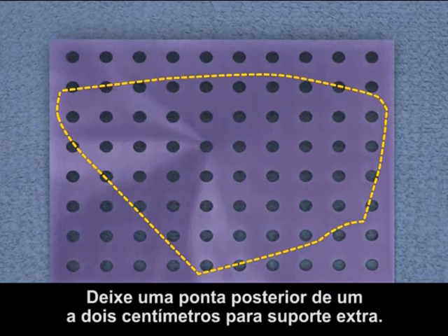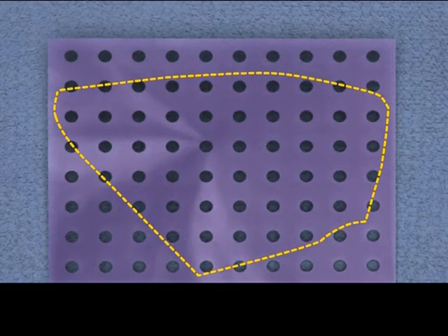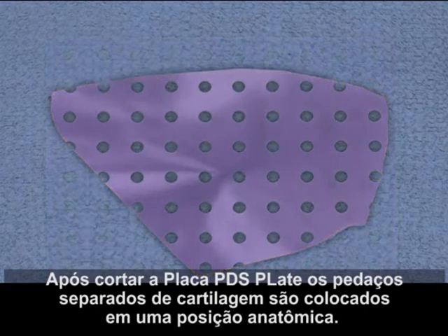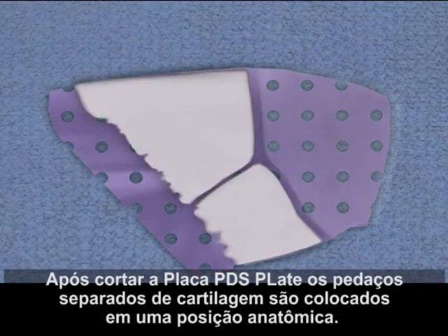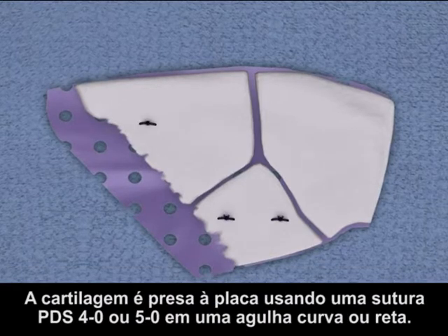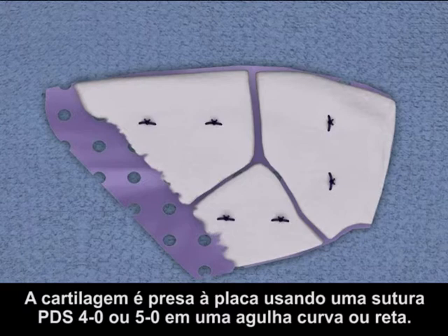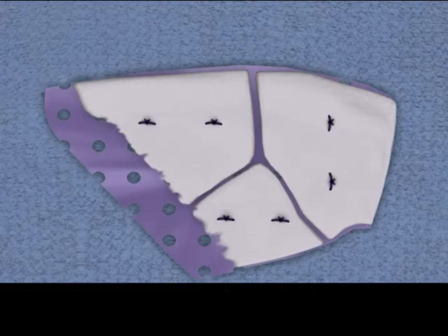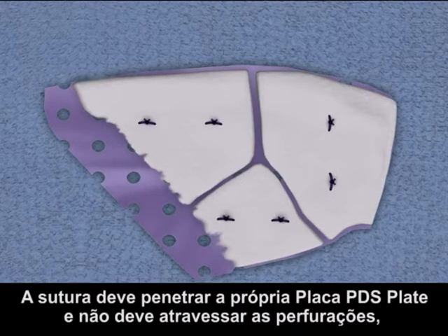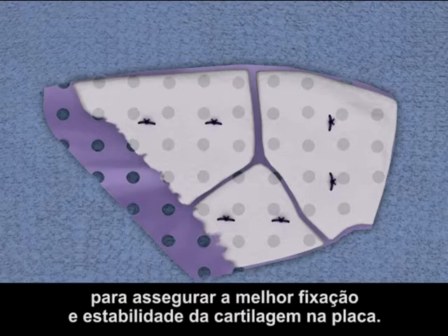Leave a one to two centimeter posterior tail for extra support. After the PDS Flexible Plate is trimmed, the separate pieces of cartilage are placed in an anatomical position. The cartilage is affixed to the plate using 4-O or 5-O PDS Suture on a curved or straight needle. The suture should penetrate the PDS Flexible Plate itself and should not pass through the perforation to ensure the best fixation or security of cartilage to the plate.